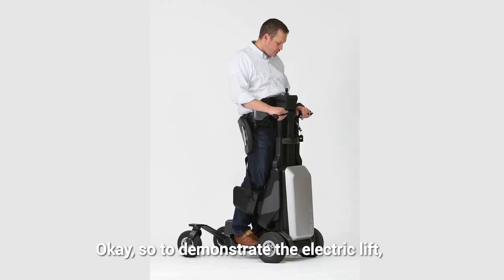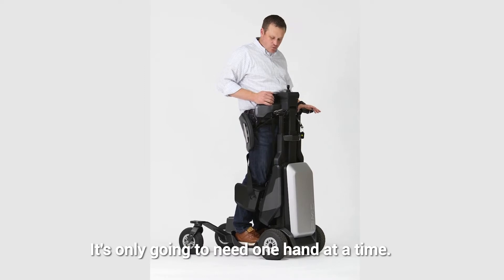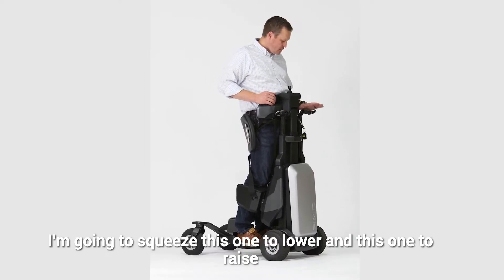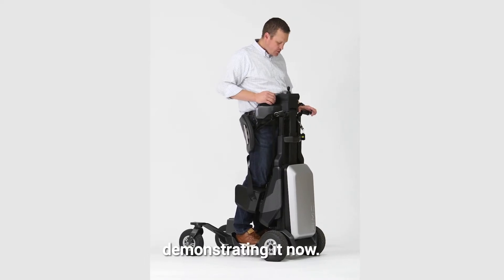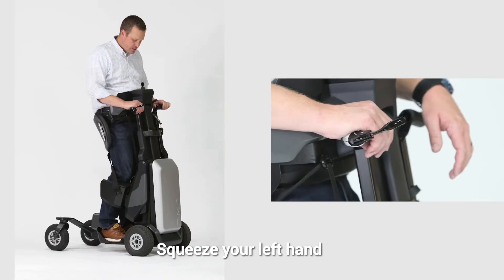To demonstrate the electric lift, it's really simple — it only needs one hand at each time. You're going to squeeze this one to lower and this one to raise. Demonstrating it now, resting this hand here and squeezing the left hand.